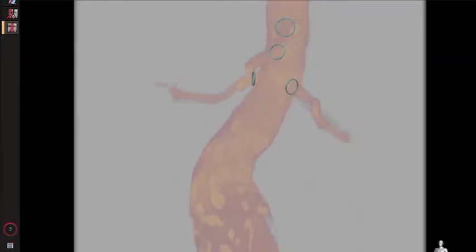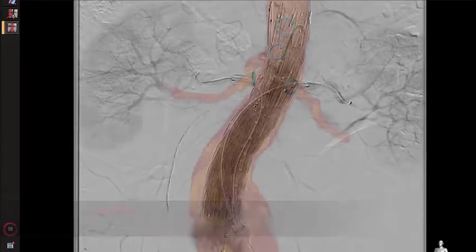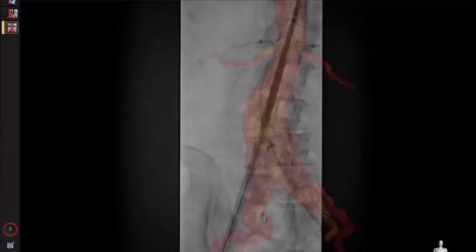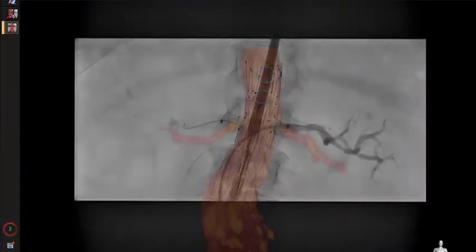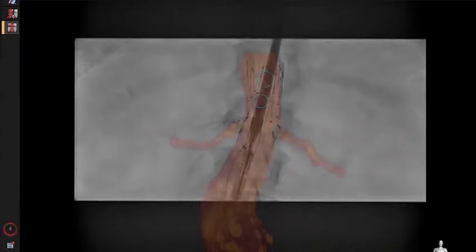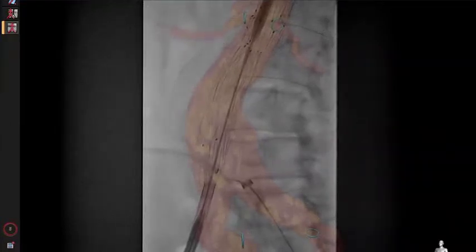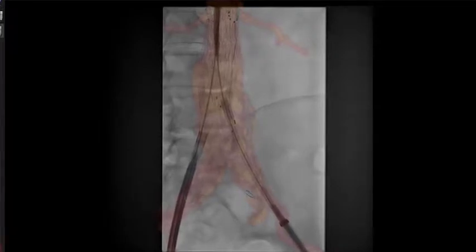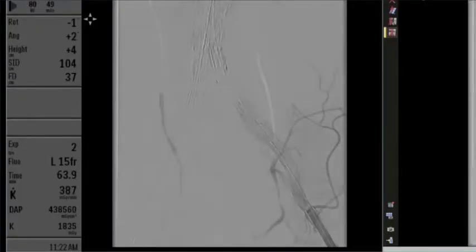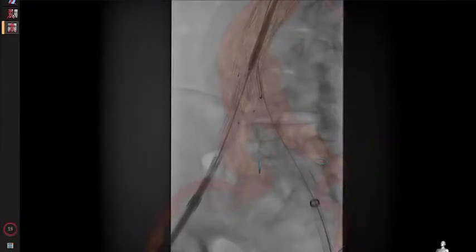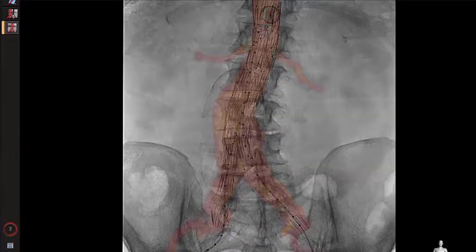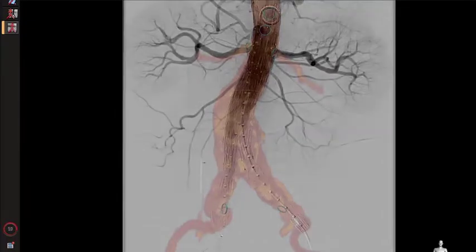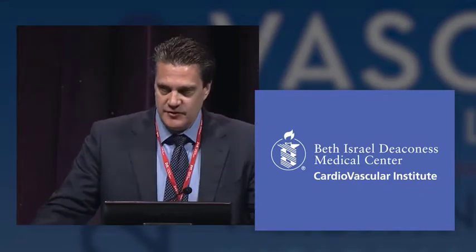After this we perform our first digital subtraction angiogram, showing patency of the SMA right at that ring location and patency of the renals. No obvious type 1 or type 3 leak. Before deploying our bifurcated system, one last puff confirms the renal spasm has resolved. We proceed with the standard bifurcated lower graft with cannulation of the contralateral limb. This patient had the hypogastric coiled preoperatively, so we extend the limb below that, perform a retrograde injection, and then a puff to show the hypogastric. One final contrast injection confirms patency of the visceral and renal segment and the right hypogastric. And we're done.